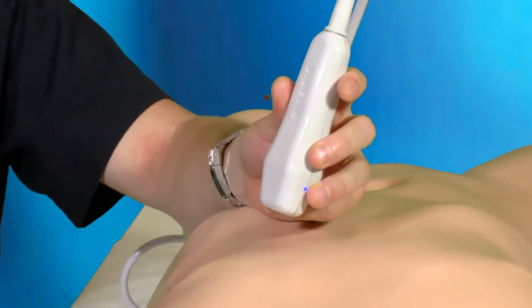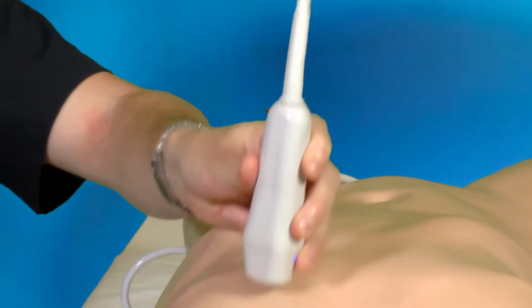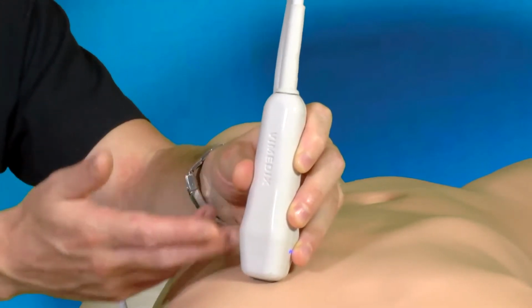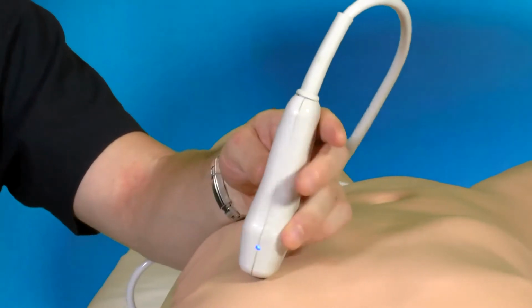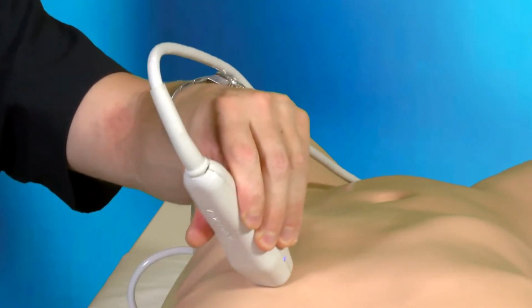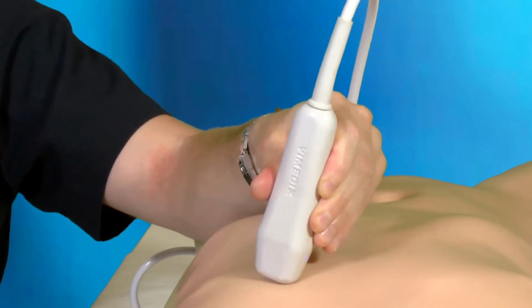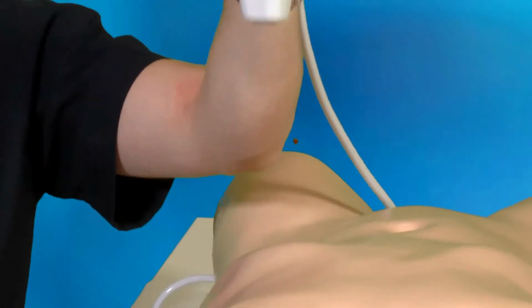The movements that I'm going to try and describe: we talk about sliding, and you can slide up or down, or you can slide right or left. And then when the actual footplate of the probe is resting on the patient, you can then talk about rotating, or we can talk about fanning, or we can talk about tilting or rocking, and that's going from side to side. And this is obviously with the imaging plane coming down from the probe.